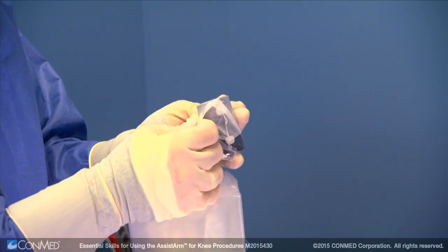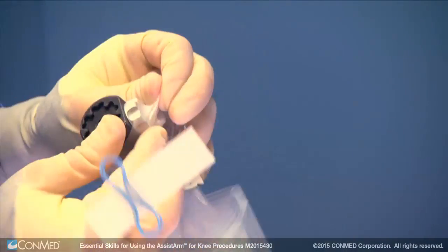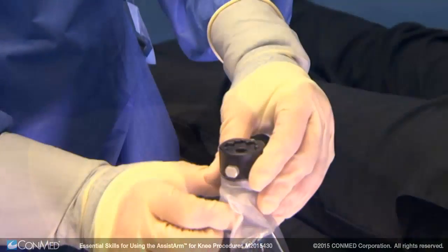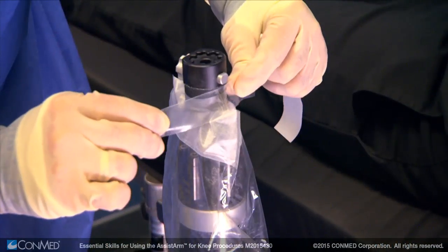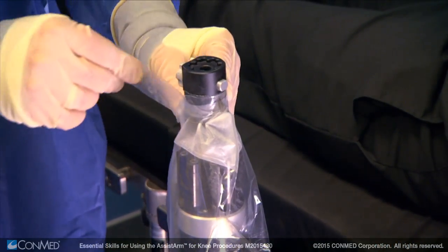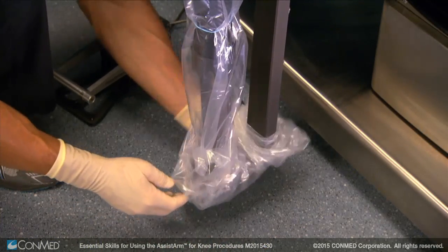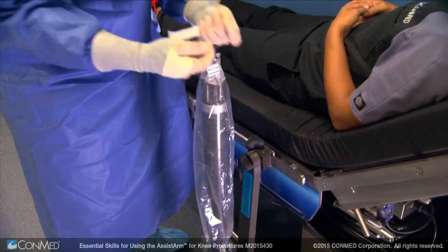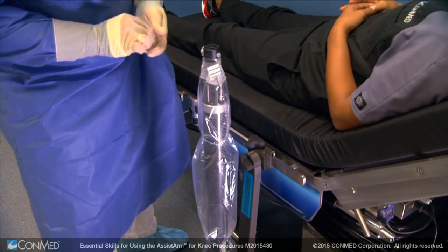A second way to drape the Assist Arm while in the sterile field is to first insert the connector into the small tapered rubber hole of the drape until it rests in between the two silver buttons of the connector. Then install the connector to the Assist Arm and give the connector a slight tug to make sure it has installed properly. Next, wrap the provided tape around the sterile drape and connector. Pull the sterile drape down the telescoping arm and place it around the lower ball joint, then place the provided sterile rubber bands around the telescoping arm to secure the drape to the positioner.